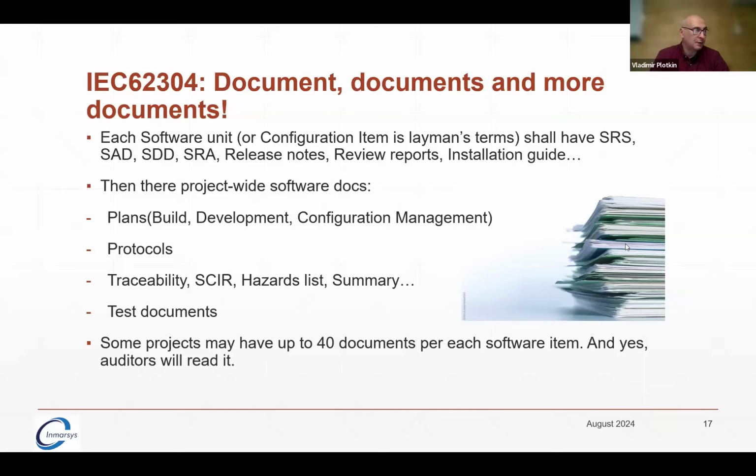You have to have protocols. Those depend on your actual software, on your product implementation. So, for example, if you have 2 different software items that somehow need to communicate with each other, create a document describing the communication protocol between the 2.